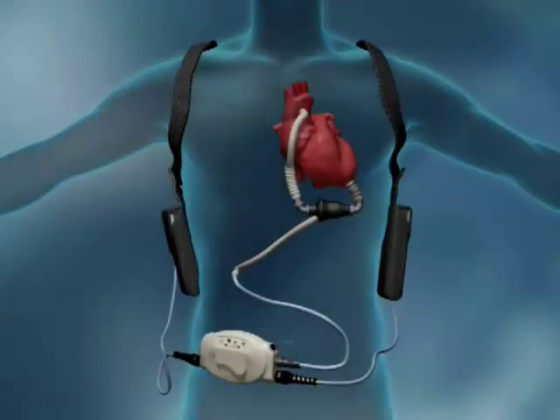The external system components of the HeartMate 2 include a small, flexible, percutaneous cable that provides power to the pump and is designed to accommodate patient activity, the system controller which controls pump operation, and the batteries, which may be conveniently worn in holsters and enable the patient to resume normal daily activities.